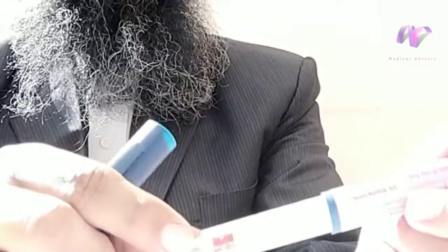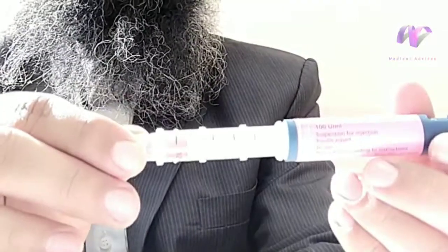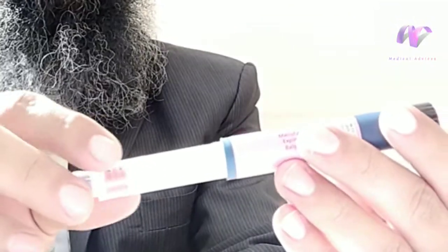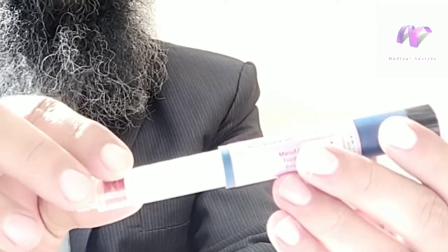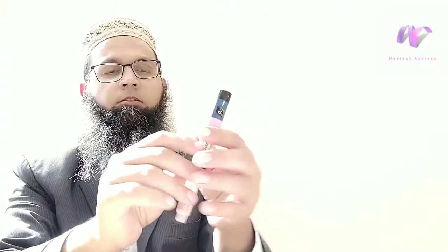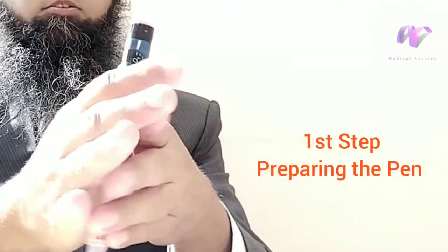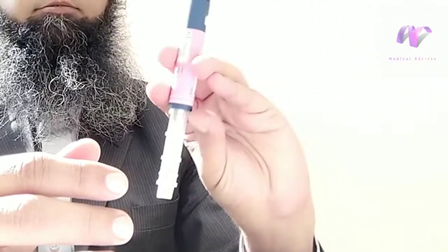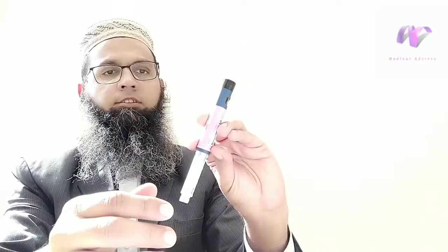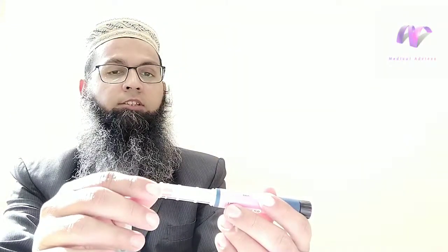Now, if you're using the insulin for the first time, then you first need to see the cloudiness. If the insulin is mixed, you first need to observe the cloudiness here. If there is a cloudy insulin, then you first need to mix it up by rolling it like this, or by rolling it like that gently, or you can do back and forth slightly and gently, so that it mixes all the parts of the insulin. This is the prerequisite for the insulins which are mixed.